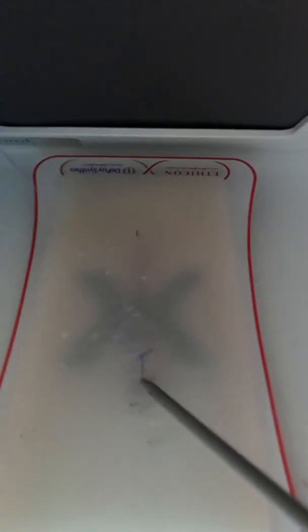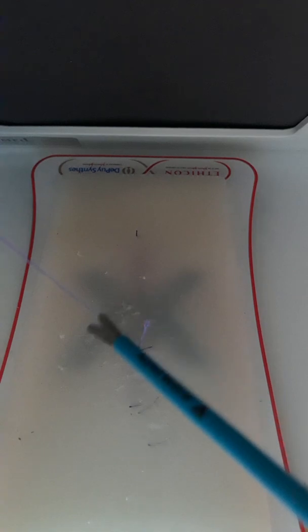And you are done with your stitch. That was intercorporeal suture with the gladiator technique. Thanks to Dr. Romeo, who I probably owe like 20 bottles of red wine because when I took the course he was challenging me to do 20 knots of this type in two minutes, and I was like there is no way. Thank you.